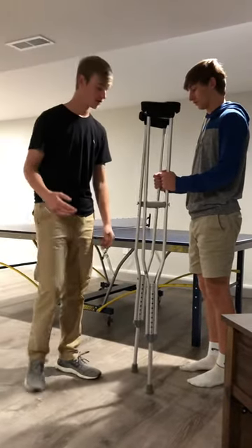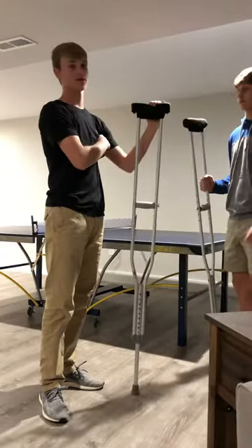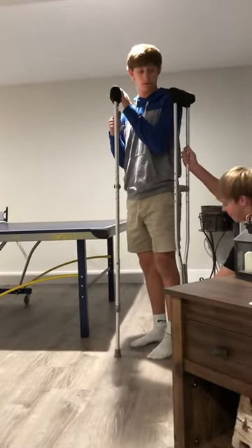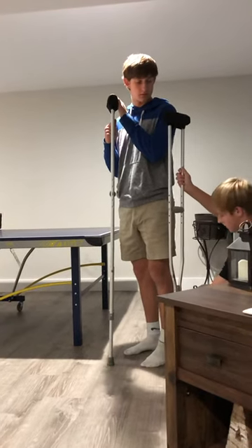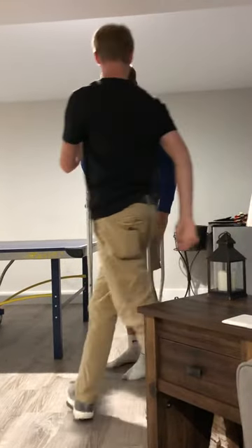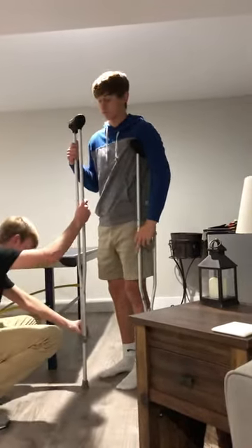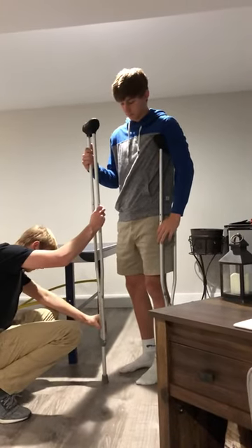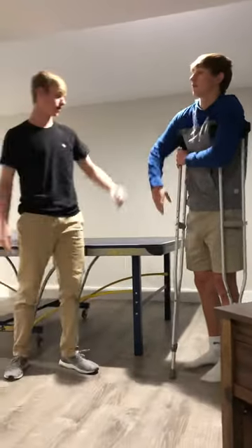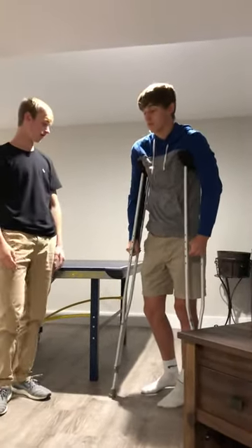Alright, so this is how to fit and use crutches. First off, to fit them, this piece right here has to be an inch below the armpit. So you just put it up to yourself and then move these down. Put your arm over there — it's about an inch right there. Now after you have these fitted, you gotta put your hand on the grips and make sure that your elbows are at a 30 degree angle.